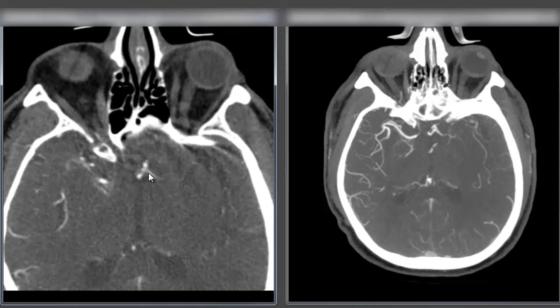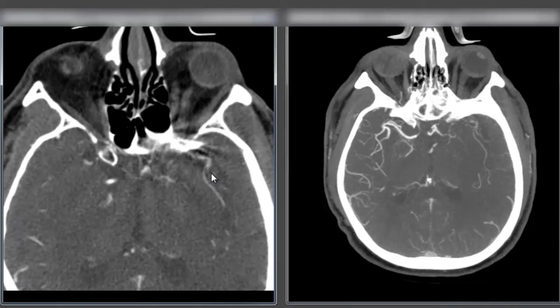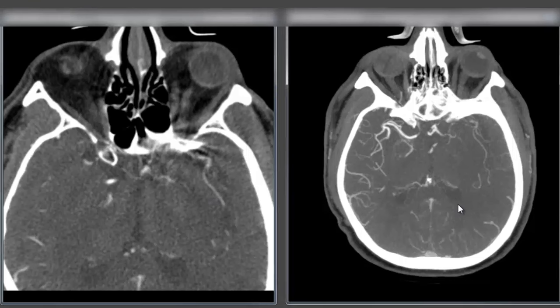We see a little bit of contrast filling in the anterior cerebral arteries here, very little to speak of, just a small amount of contrast in the middle cerebral artery a little bit more distally from that clot.